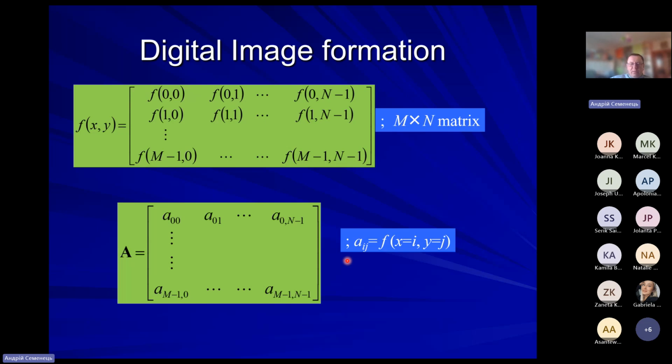So that's actually the reason why sometimes, maybe not quite often in modern times, but before it was very often, when we're talking about a digital image, it has been called a matrix image, because it is formed by a matrix of pixels, a matrix where each element represents information about a particular pixel at given coordinates. So our digital image is this one matrix. And here is an absolutely obvious consequence. So, a major point you have to understand.